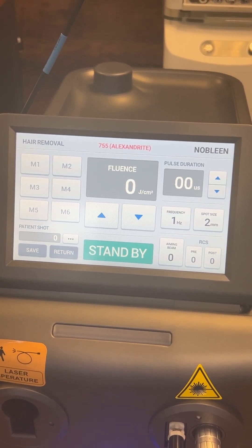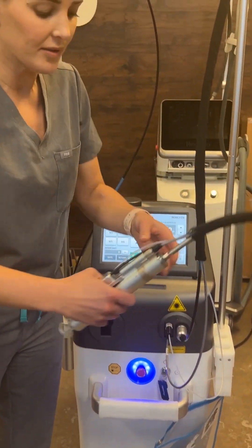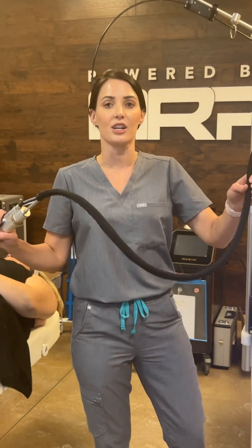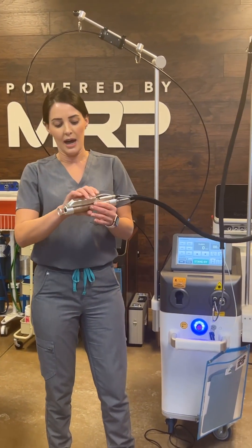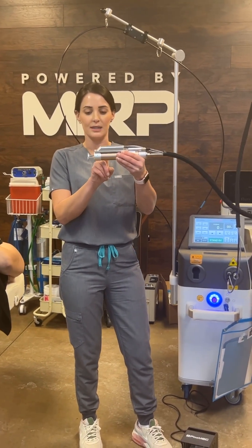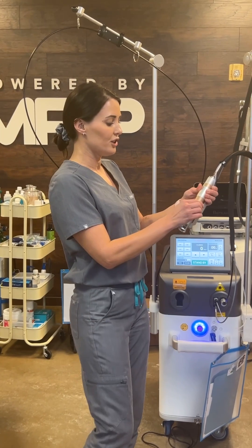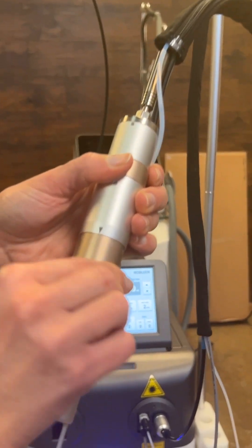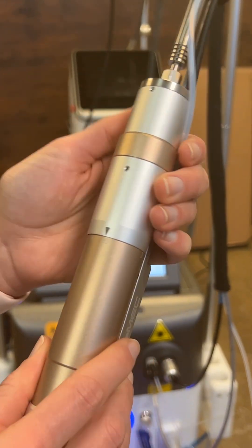This device does not need ultrasound gel. The handpiece is really nice and easy to hold. It doesn't interfere — you have this nice long cord so you can actually go over the patient and move around. This is actually the cooling system right here, this is the spot size, and this is how you change to what spot size you want. As easy as that.